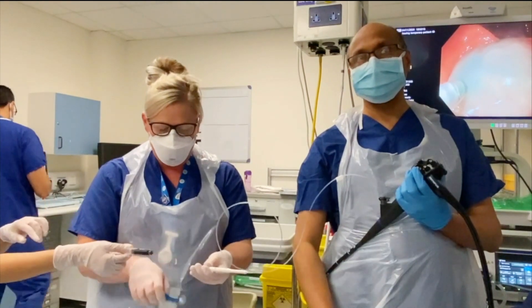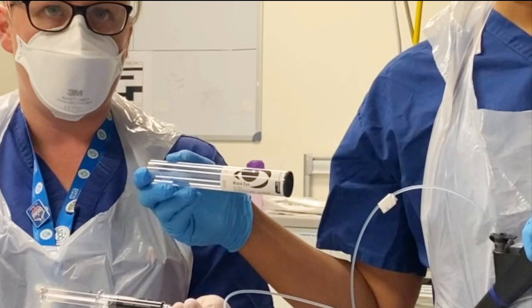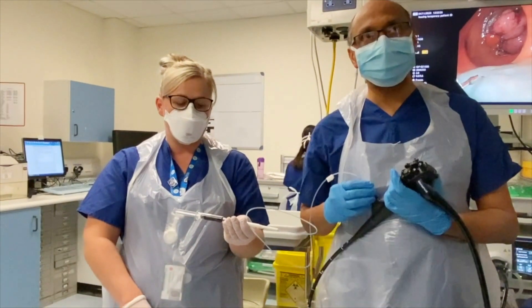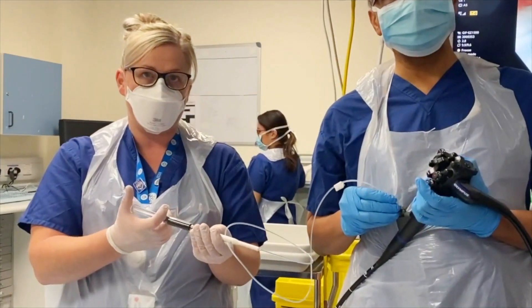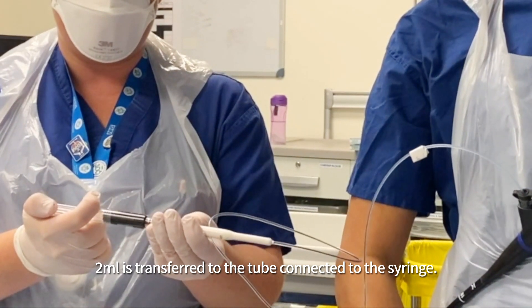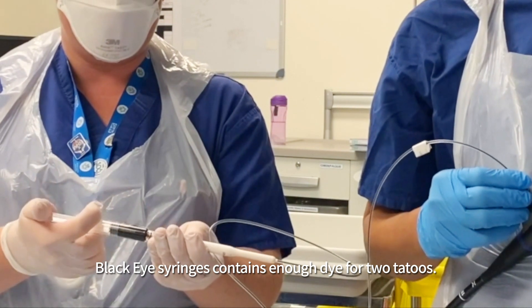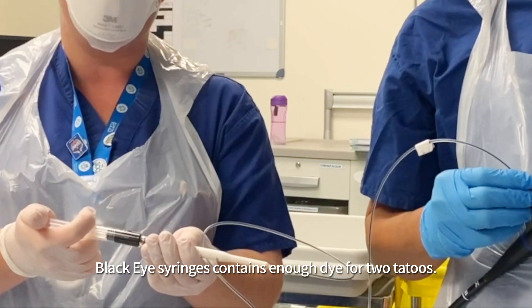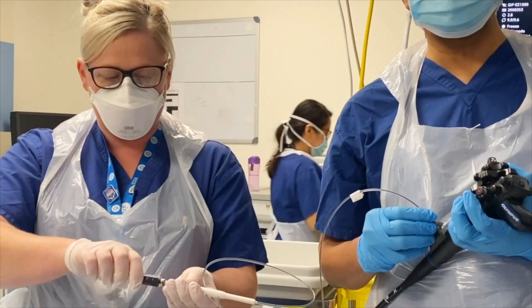We're going to use a tattoo ink now — 'Black Eye' — which gives very good tattooing. I'll put the needle back into this bleb and inject the tattoo. Just inject 2 ml please. Stop — 2 ml. Now change the syringe back to the normal injecting solution and keep the needle out.